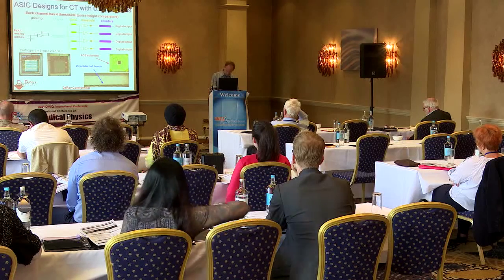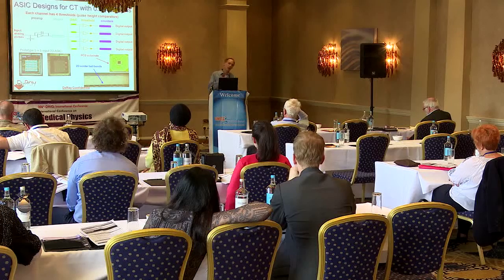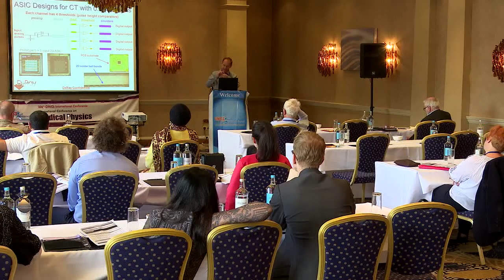Here's a picture of the new ASIC. In addition to making new smaller pixels in the cadmium telluride or the cadmium zinc telluride, it was also needed to go to a new architecture of the ASIC in order to keep that stray capacitance that I was talking about very, very low, to keep the electronic noise low. The ASIC needs to be very physically close to the pixel itself. And the only way to do that with these small pixels is to go to a two-dimensional ASIC, which is done and attached to the sensor directly by a flip chip bump bonding method.